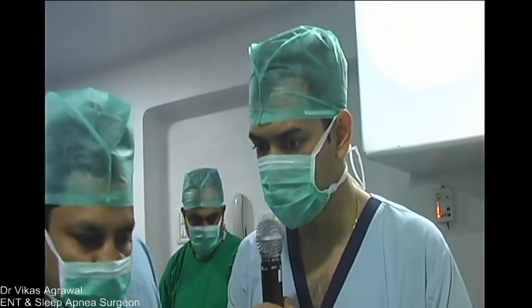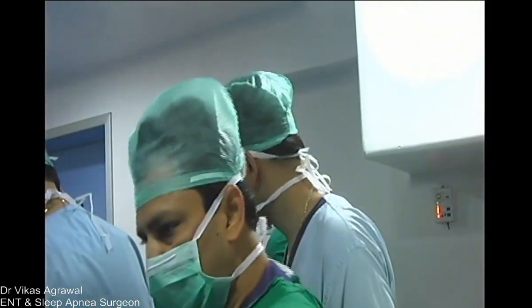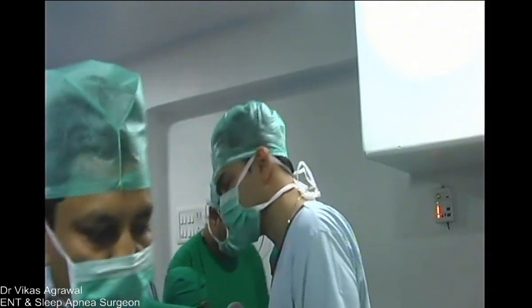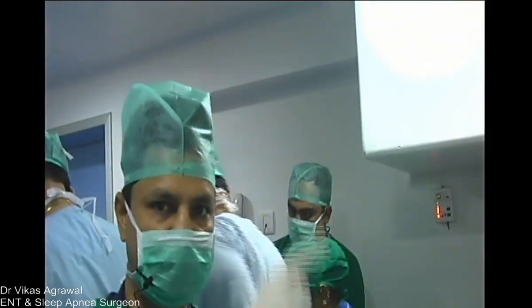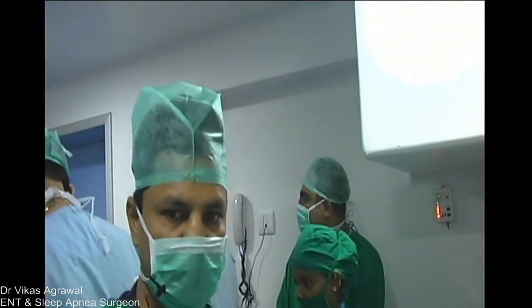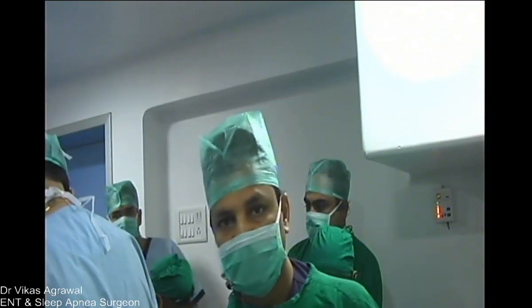So now that our patient is already induced, Dr. Harsha is going to paint and drape the patient. So what we are going to do now, if we have a multi-level surgery to do, like in this case we have a septoplasty, turbinoplasty and uvulopalatopharyngoplasty to be done. So what should be done first?